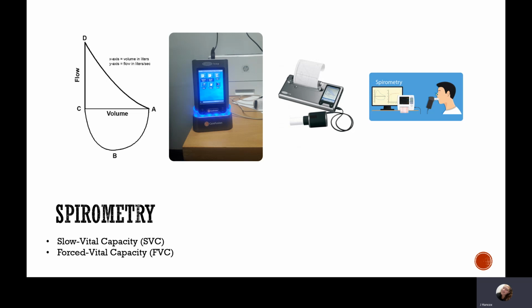In some cases, we will give the patient a bronchodilator after they do the test and then have them wait for 15 minutes and repeat the test. So a bronchodilator is basically like asthma medication. It's a pump that they will take, and then we will assess their airway function afterwards to see if there's any difference. Most of the time, patients that have obstructive diseases will have a positive difference in their post values, so after they take the bronchodilator, because the medication helped to open up their airways and improve their lung functions.